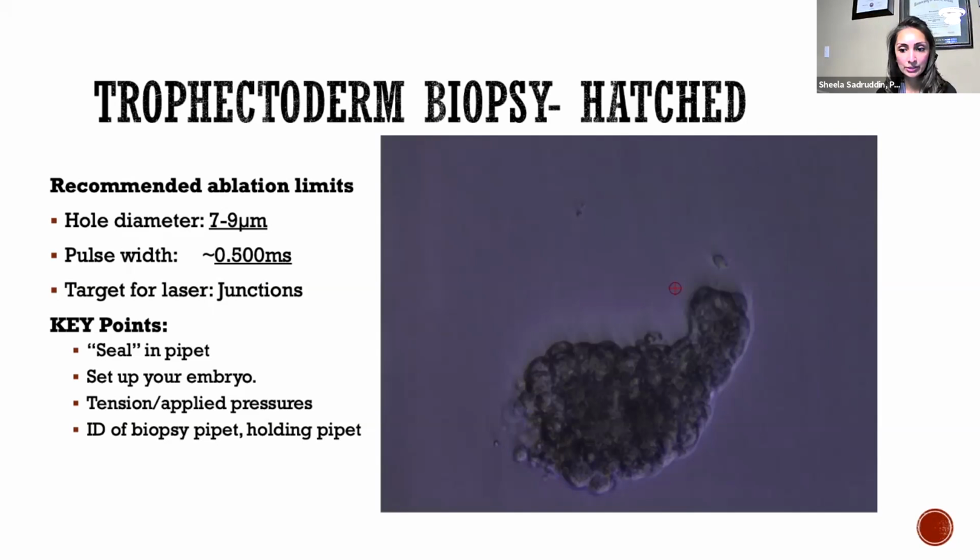And in one of the presentations that I saw, the very first one, Dr. Winninger showed a pipette that was beveled and had a smaller opening. So that certainly helps with the controls. Roughly about 25 to 30 microns inner diameter tends to work the best. The biopsy procedures that you saw here were a 40 micrometer inner diameter, so slightly larger than what I'm mentioning. Okay, next slide.